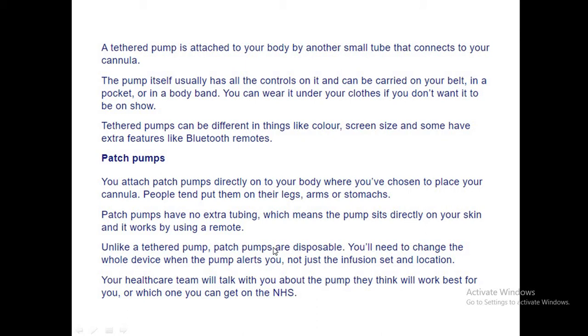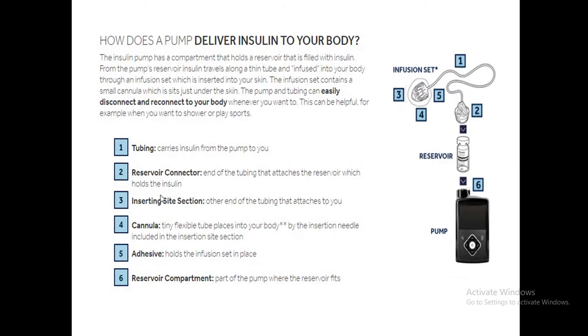Patch pumps are disposable — you need to change the whole device. With a tethered pump, you only need to replace the infusion set. In the basic pump diagram, you can see the tubing that carries the insulin and a reservoir connector that helps connect the tube with the reservoir.